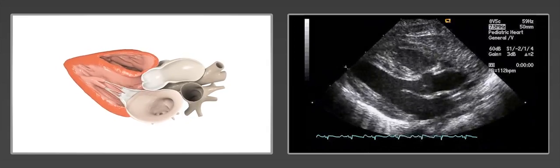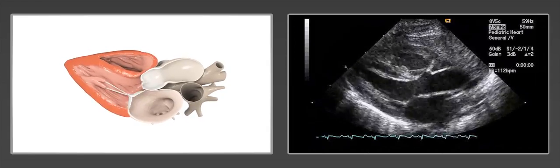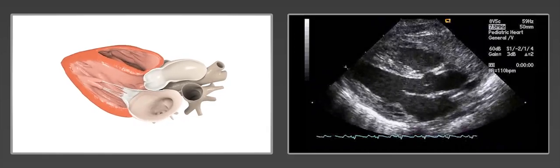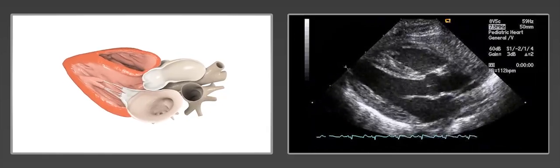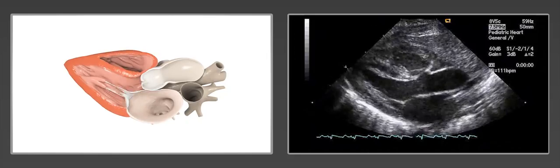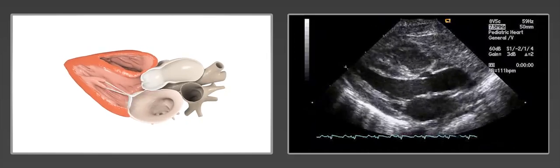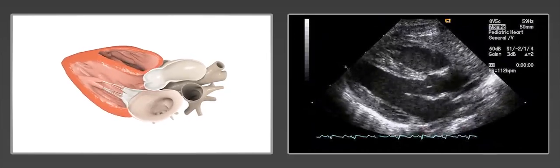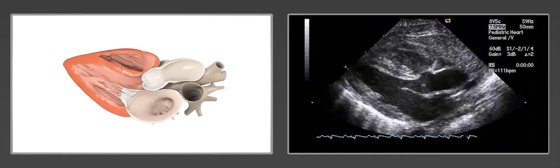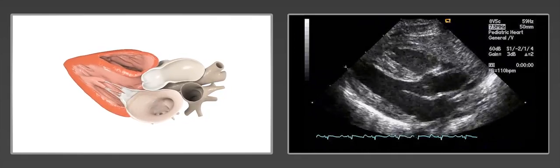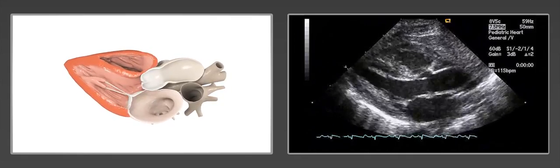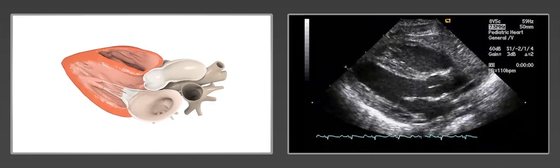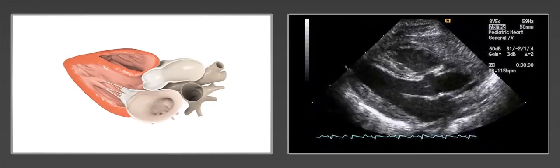Standard measurements of the left atrium, the left ventricle in systole and diastole, the right ventricle, the interventricular septum, the aortic root, the ascending aorta, and the pericardial space are obtained from this view, with careful attention for suspected aortic stenosis and functional measurements. This view is also important for evaluating pericardial or pleural fluid accumulation.